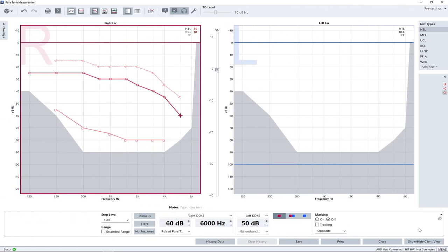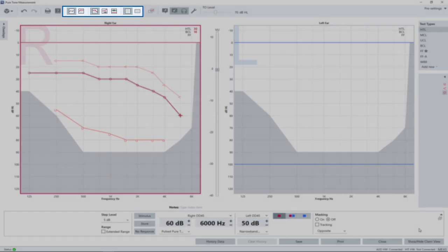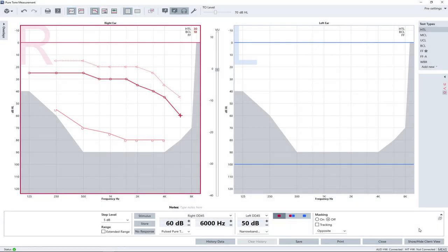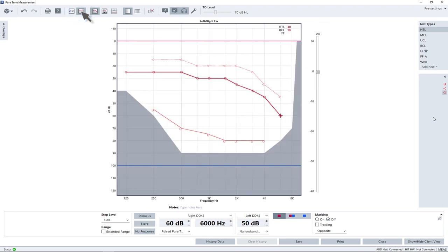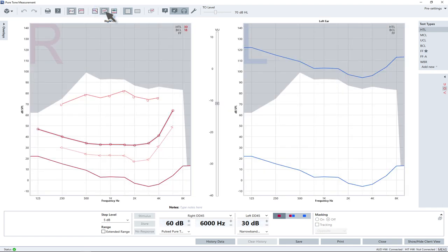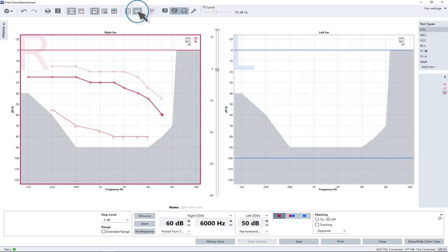To adjust the display to your needs, use the icons in the top panel to show audiograms separately per side or overlaid in one grid. Also, audiograms can be displayed in either HL or an SPL view. When using high-frequency headphones, the displayed frequency range of the audiogram can be extended with the top panel icon.